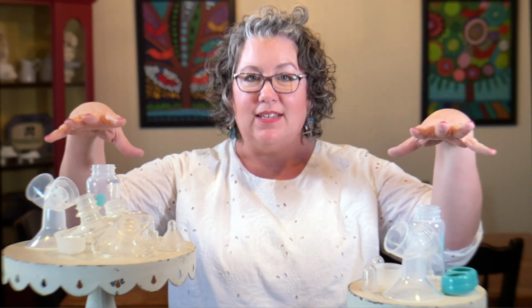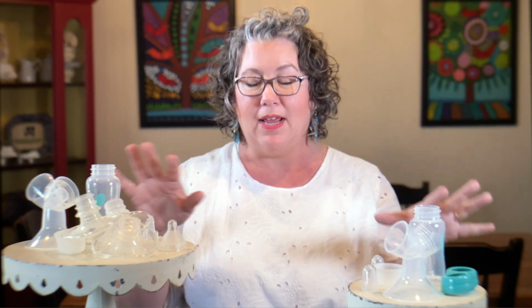Now that you're ready to sanitize your pieces, the first thing you'll do is get a large pot of water. Then put all of these pieces into the water and put it on the heat. You'll want to bring the water to a full boil and then set the timer for 5 minutes. While your pieces are boiling, grab a long spoon and give it a stir every few minutes. The point of stirring is to make sure all of the pieces have a chance to be submerged into the boiling water.